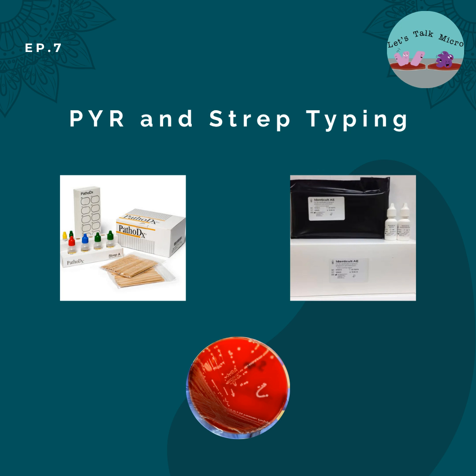Now, I have been in labs where they don't perform the extraction, because by doing that process, you're extracting the antigen from the cell wall. I've seen places that just add the latex, because the kit comes with the latex for that specific Lancefield group, and then they mix their colonies with it and observe for agglutination. In my experience, I don't like it. I think it's best with the extraction. Even with a smaller amount, it works out beautifully. I have gotten questionable reactions with just using the latex.